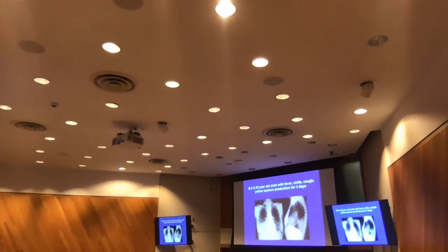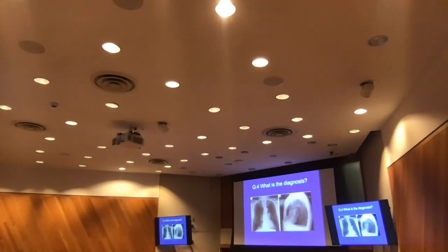Right or left? Which side is abnormal? You look at the PA view, the right side looks whiter here. And you see on the lateral view, which lobe? Write it down. Is the right sided abnormality confirmed on the lateral view to be the upper or lower lobe? What is the abnormality? I use the features to let you know which lobe it is, just the area of interest. So write down the lobe. This tells you it is right sided, and this tells you which lobe it is. Good. Move on. Number 4.